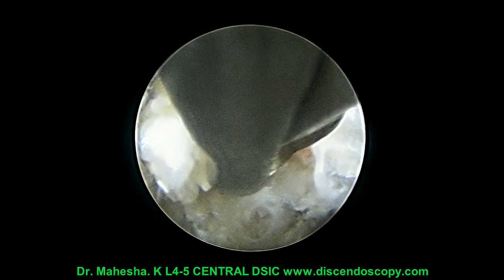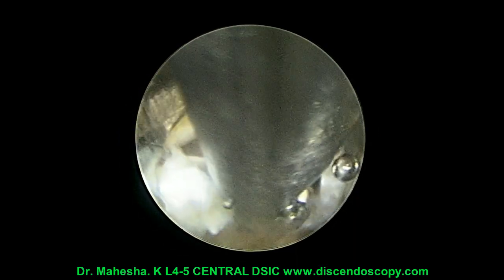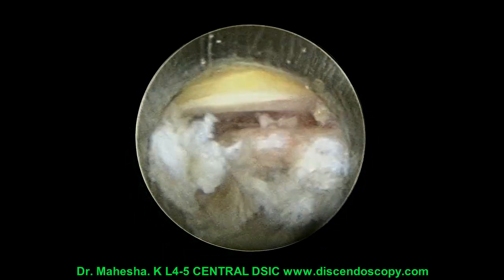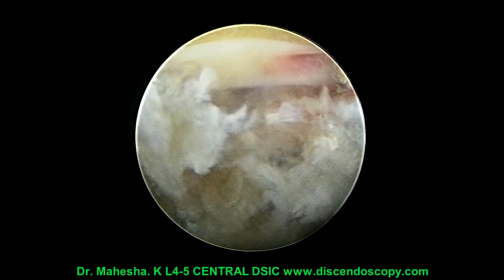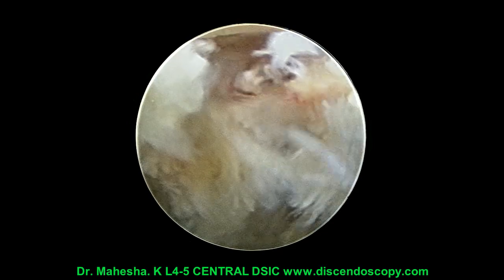Then we use this annular cutter to do annulotomy. Here I am using an oblique annular cutter to do the annulotomy.